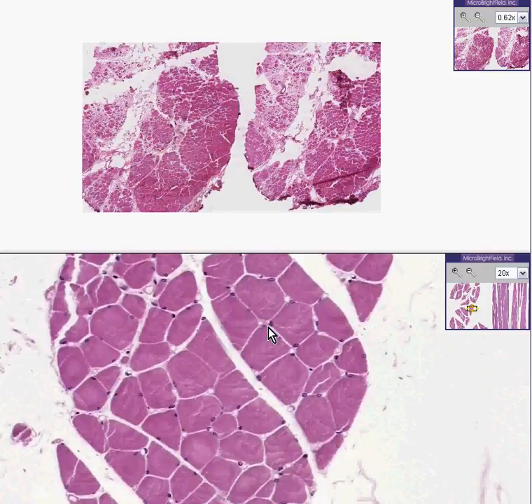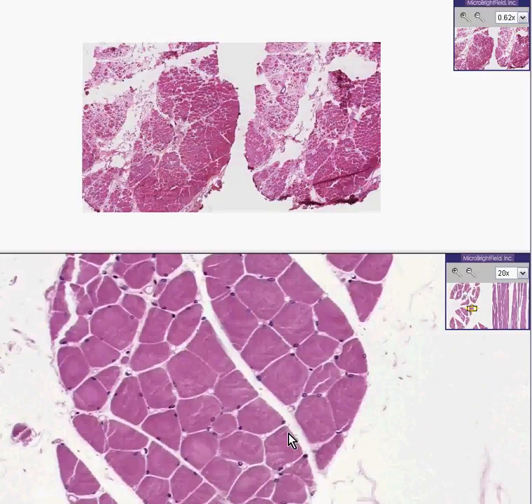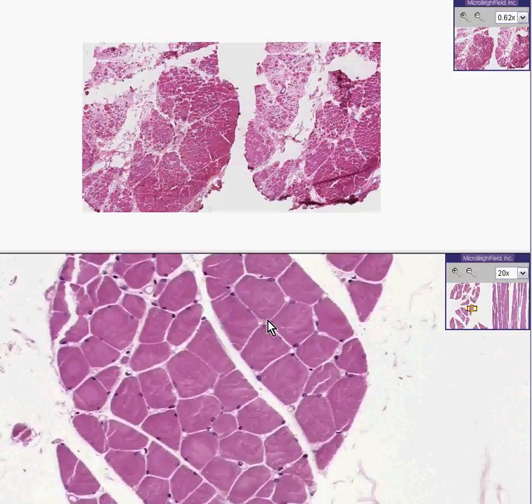Here at the bottom we have absolutely normal skeletal muscle fibers. These are cut in cross sections — that's why they look round rather than like logs. Notice they are uniform in general staining and generally about the same size with respect to each other. They are separated by small bands of connective tissue here and there, but the fibers themselves are not replaced by fat or connective tissue in any way. Like classical skeletal muscle, you can see that the nuclei are oriented at the periphery.